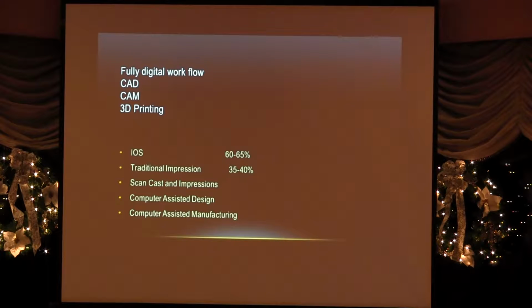So in the traditional impression, we have scan, casts, or impression. Then CAD is computer-assisted design, meaning anything we scan, or an intraoral scan, we're going to design with the computer software, and then finally we're going to do computer-assisted manufacturing, which is CAM, which could be milling or 3D printing.